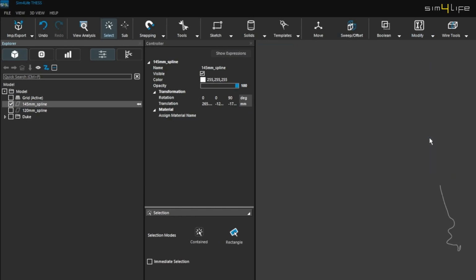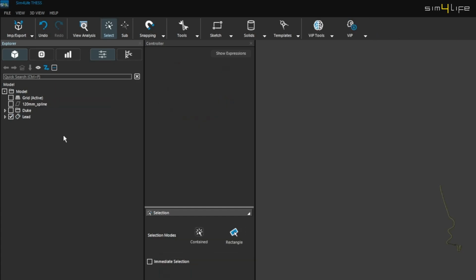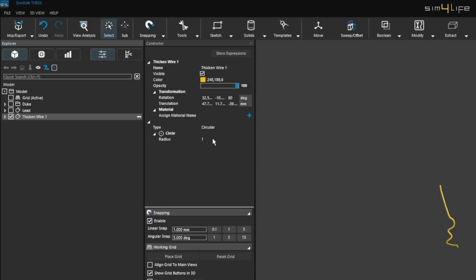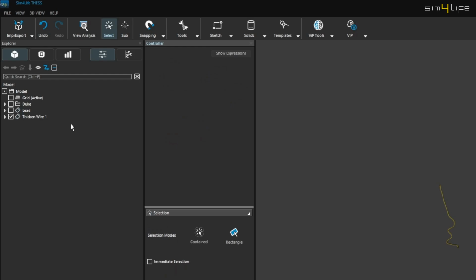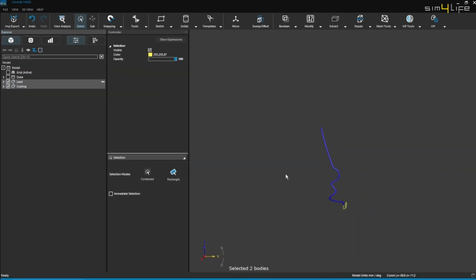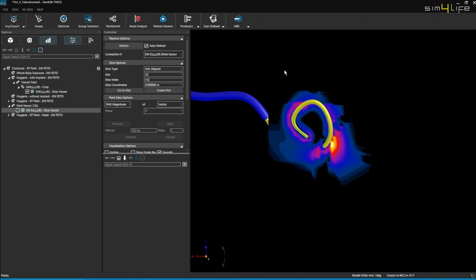First, we select the 145 mm spline to represent the lead. From the ribbon, we select modify, then choose thicken wire, and set the radius to 0.3 mm. Next, we create a shorter spline, 120 mm in length, and repeat the process, thickening it to a radius of 0.55 millimeter. This results in a model where the tip of the lead as it enters the cochlea has 25 millimeters of exposed wire, simulating the electrode, where maximum power deposition is likely to occur.